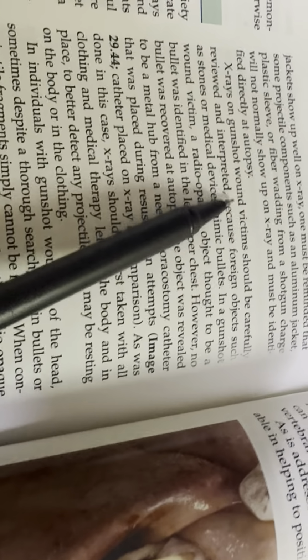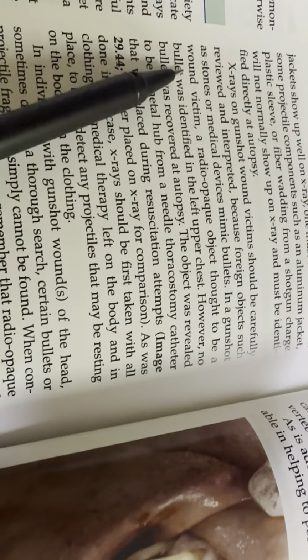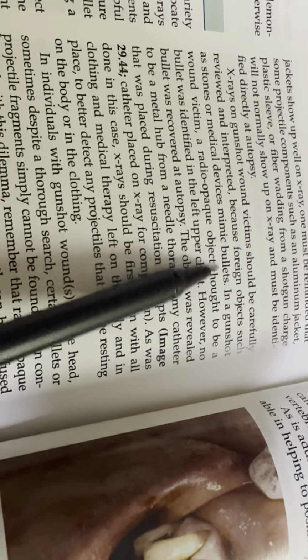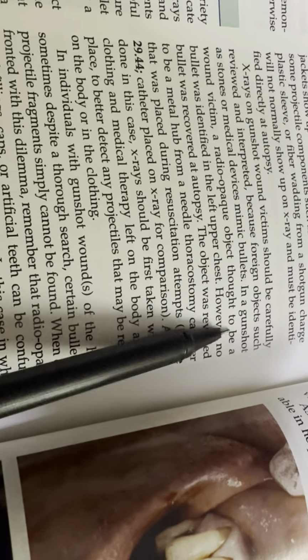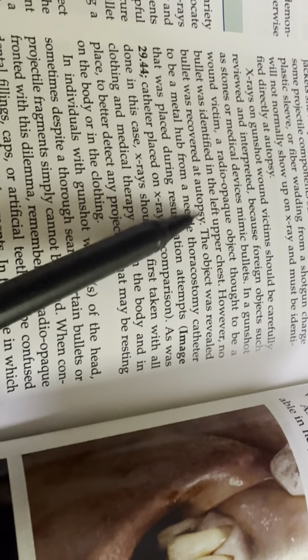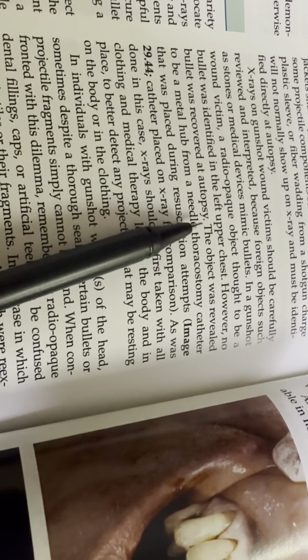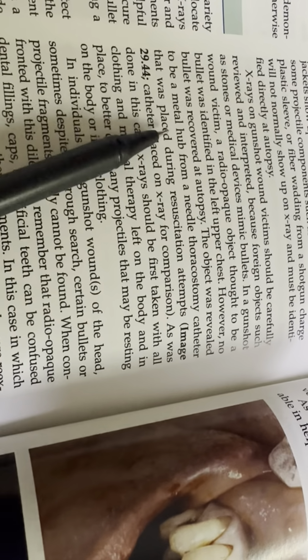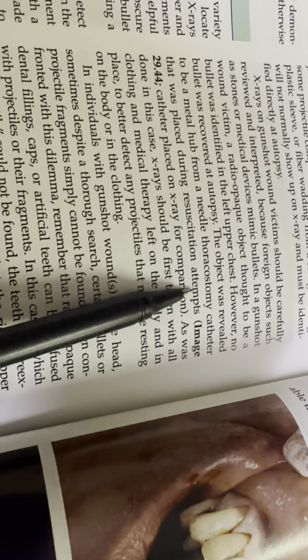X-rays on a gunshot wound victim should be carefully reviewed and interpreted because foreign objects such as stones or medical devices can mimic bullets. In a gunshot wound victim, a radio-opaque object thought to be a bullet was identified in the left upper chest. However, no bullet was recovered at autopsy. The object was revealed to be a metal hub from a needle thoracostomy catheter that was placed during a resuscitation attempt.